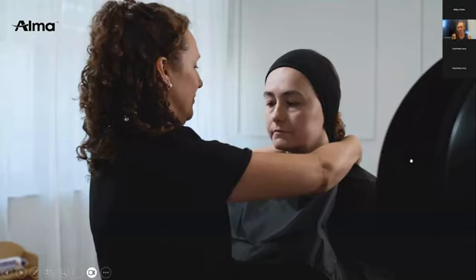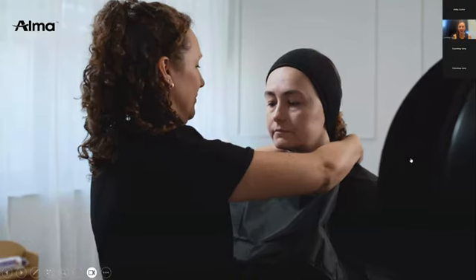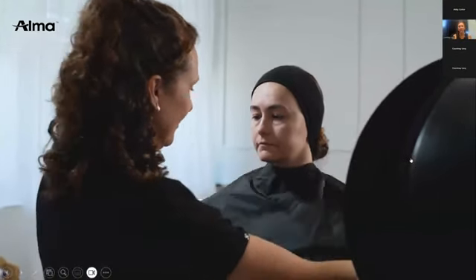This is just a short video of me preparing a patient for Alma IQ image capture, and I'd just like to take this opportunity to mention we have very, very good training videos for the Alma IQ involving installation, setting up the app, setting up the catalog, and of course capturing and analyzing the images.